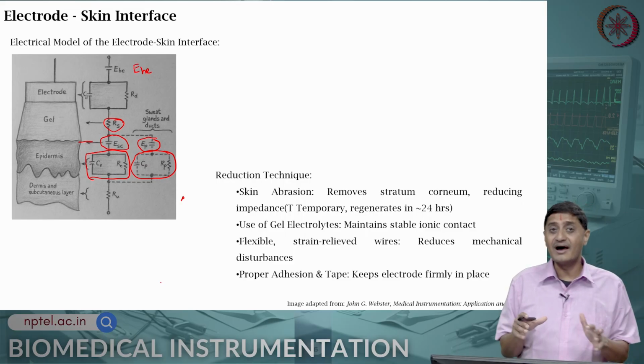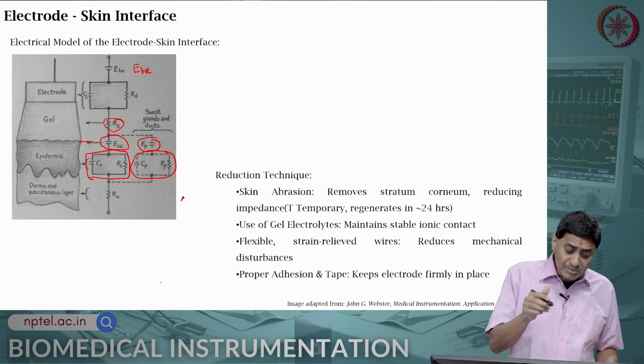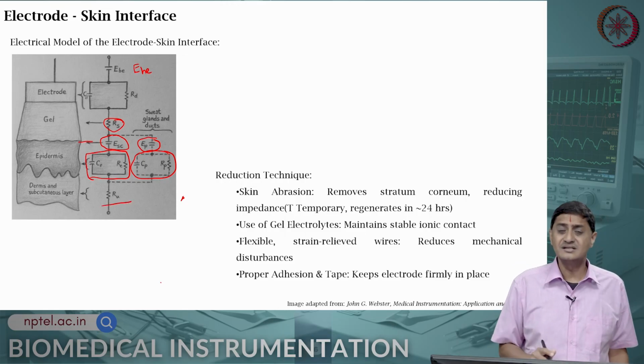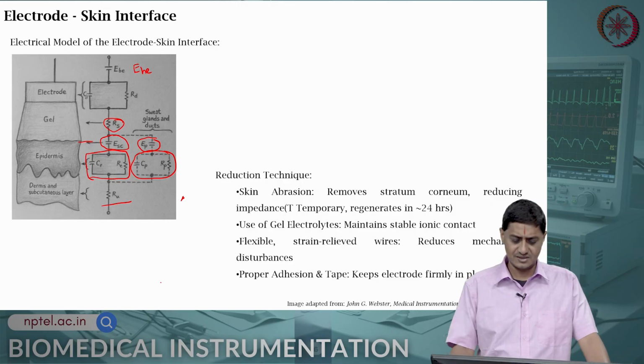These are the other things that are not frequently considered. Then below all this, you have the resistance offered by the subcutaneous layers.